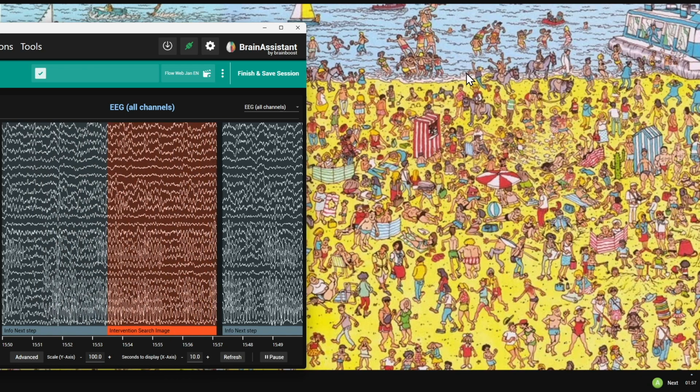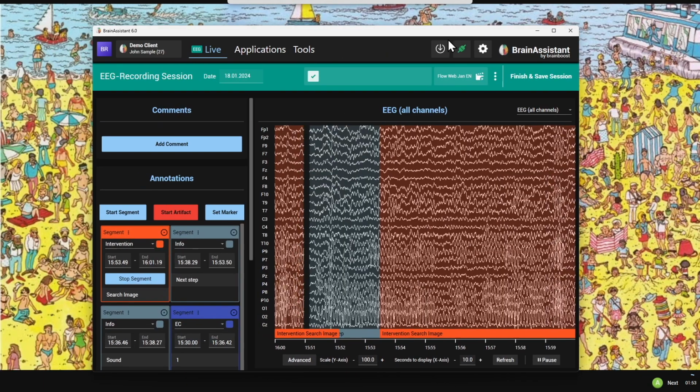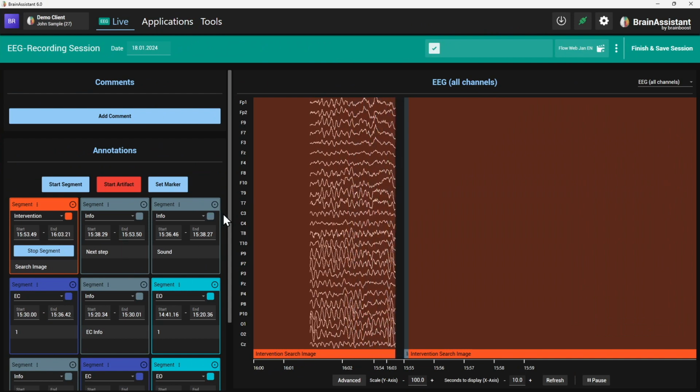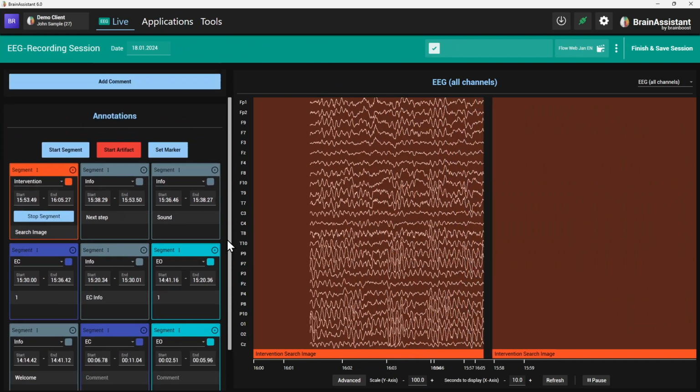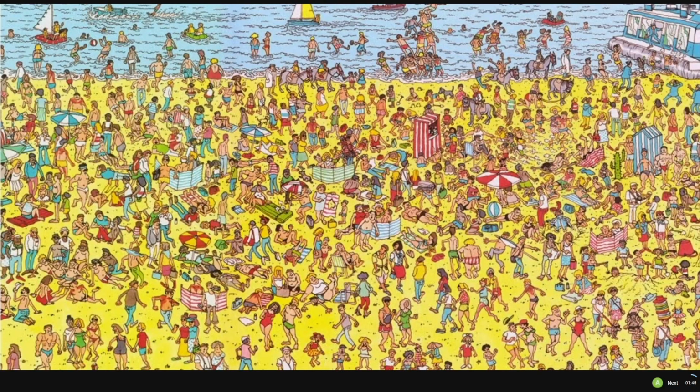You still have control as a client sitting there, but I'm just saying you can also control it as a trainer. And you see we have quite a few segments here. We can delete them later, but at least we have an overview of what happened when. And now this was the search image.